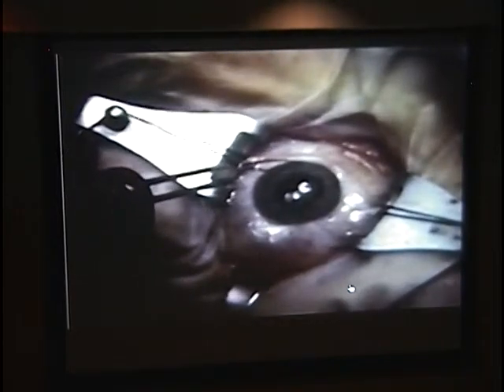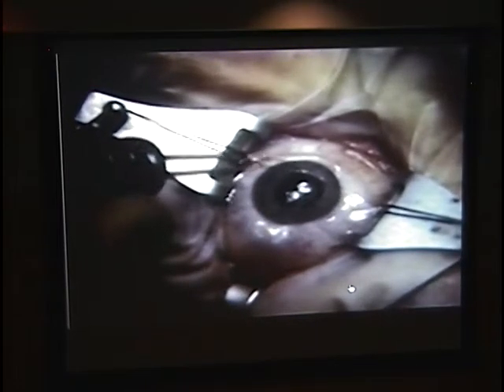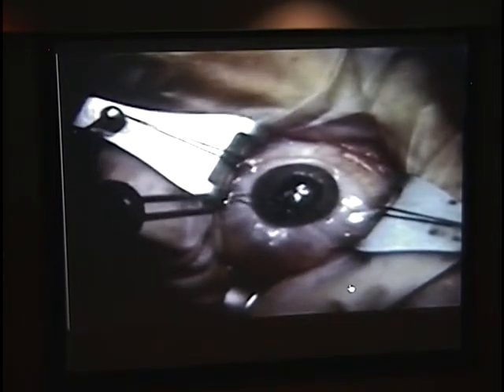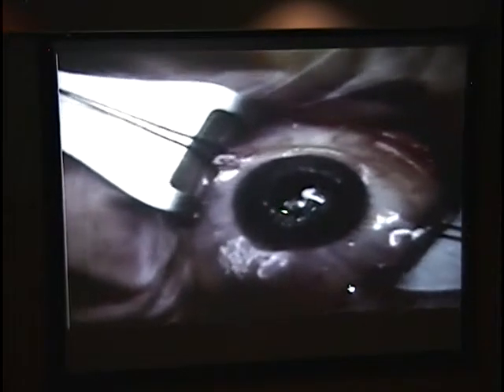The same trephine is pressed on the patient's cornea to make a mark in the epithelium. Hildreth cautery is placed just inside the trephine mark at the flat spot or flat meridian of the patient's cornea. Notice the traction lines as the anterior corneal collagen contracts, drawing in a thermal wedge of tissue from the peripheral cornea to be cut and discarded with the pathology button.